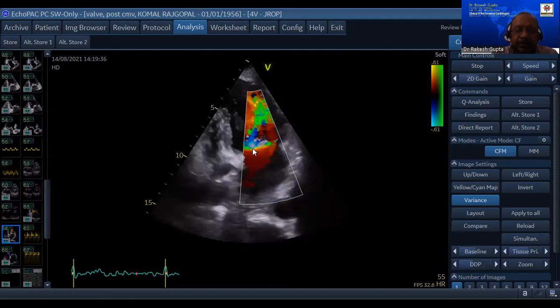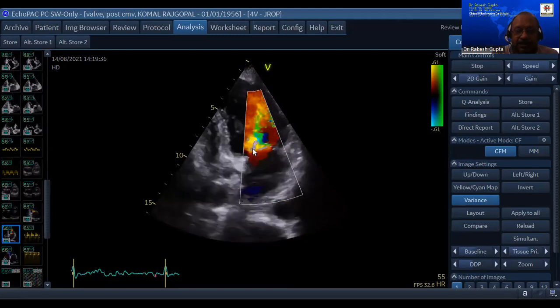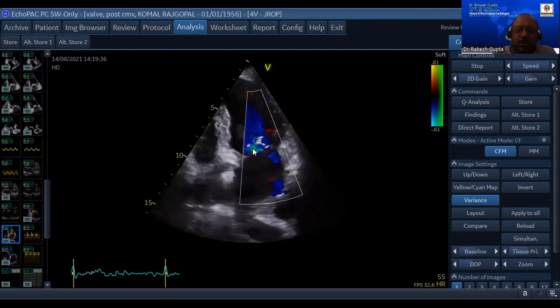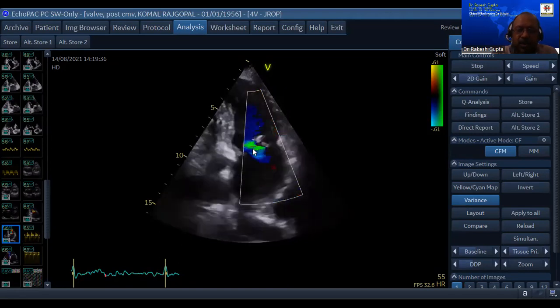Sorry. When we do this blind procedure, we do over dilatation. And when we do over dilatation, there is a potential gap between two leaflets to give you a mitral regurgitation. That is why, whatever the BMV or CMV we were doing, we do not have any mitral regurgitation before they take up these people. And there should not be calcium on the commissures to take up these people for commissurotomy by the balloon or closed.